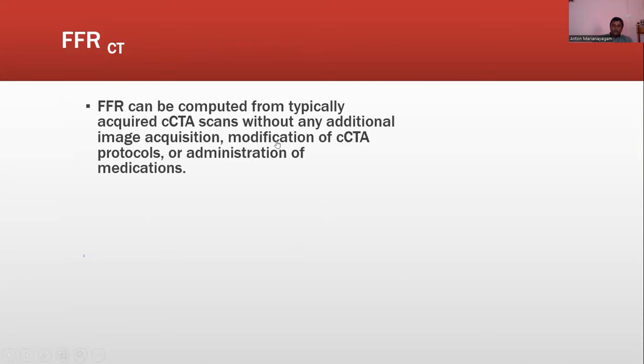The patient may be undergoing a percutaneous intervention after going through the CT coronary angiogram and the plaque characteristics. If it is between 0.75 and 0.8, then it is on an individual case basis, selecting cases for intervention and medical management.